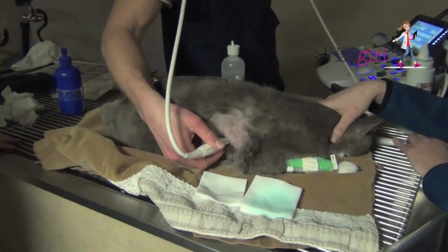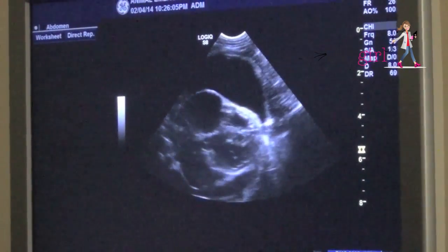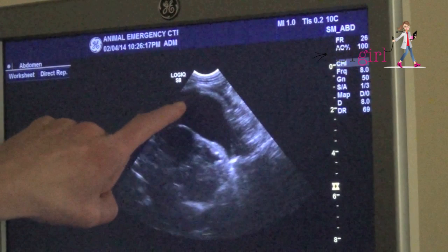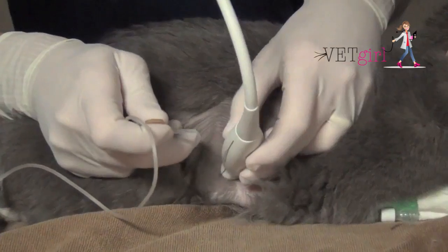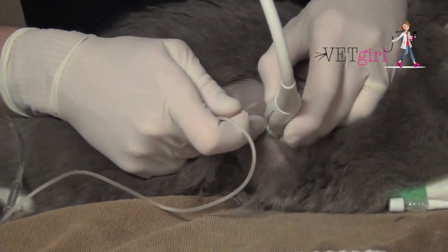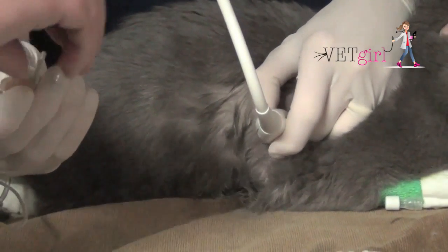If you have an ultrasound, we want you to be able to do a FAST ultrasound to look for the presence of that large, black, hypoechoic pocket. Here, you can see we're using the FAST ultrasound to identify the best location. You want to use sterile technique — a three-way stopcock set up with a butterfly catheter and syringe.